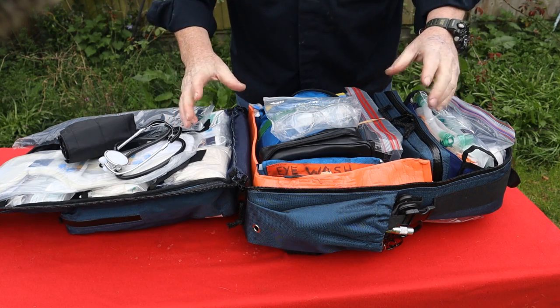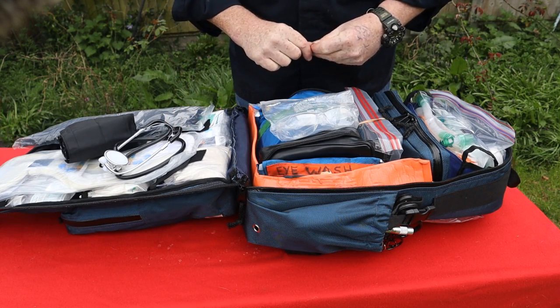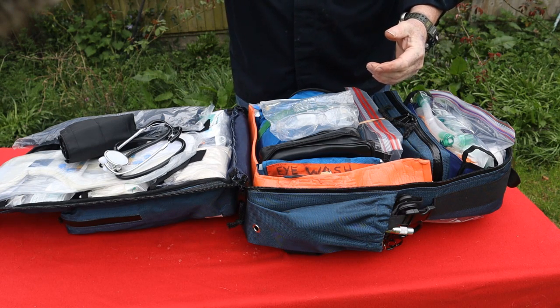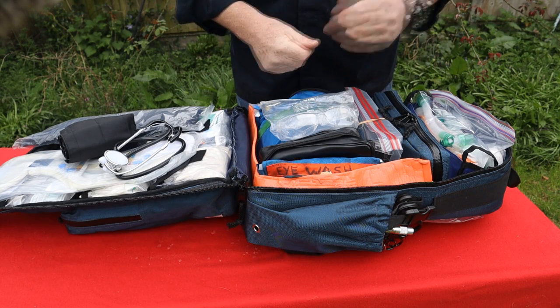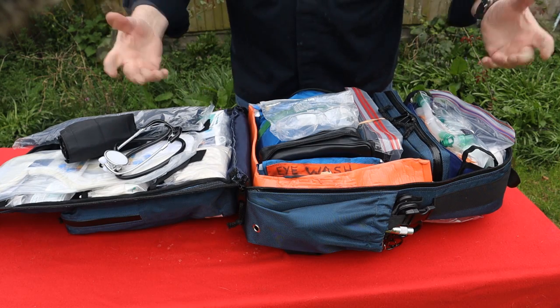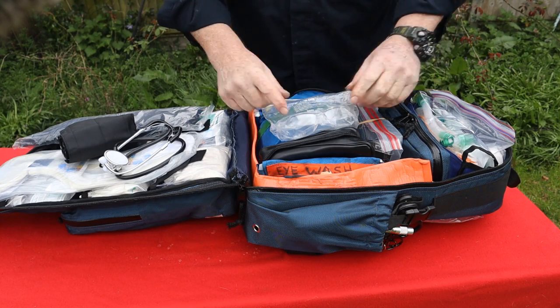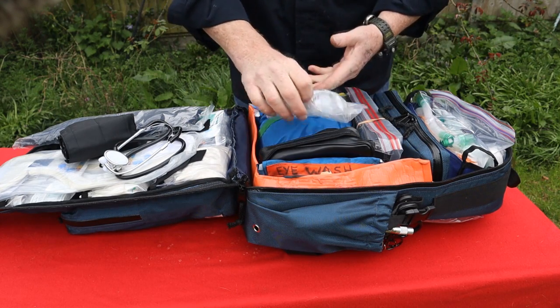So any risk of cross contamination, I've put my glasses on. The only thing I really want to take home to my beautiful little family is me. I don't want to take home hepatitis B, hepatitis C, HIV, any other infectious disease. So any risk of that, and I'll put my safety goggles on.